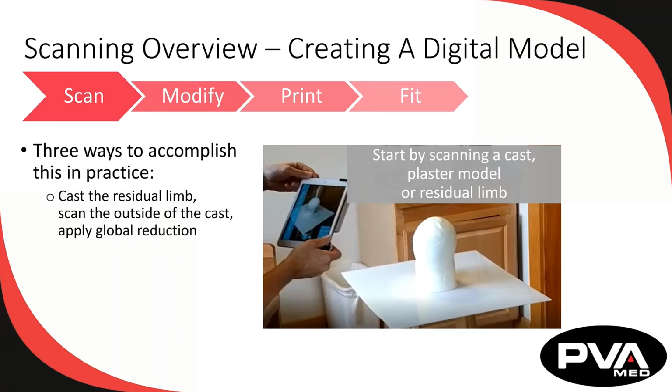There is also a slight variation of this first technique, which has gained popularity over the last few years, which adds the advantage of casting a weight-bearing shape of the residual limb using such tools as a Symphony Aqua system. Some clinicians report very positive patient outcomes, such as a zero-ply fit as a result.